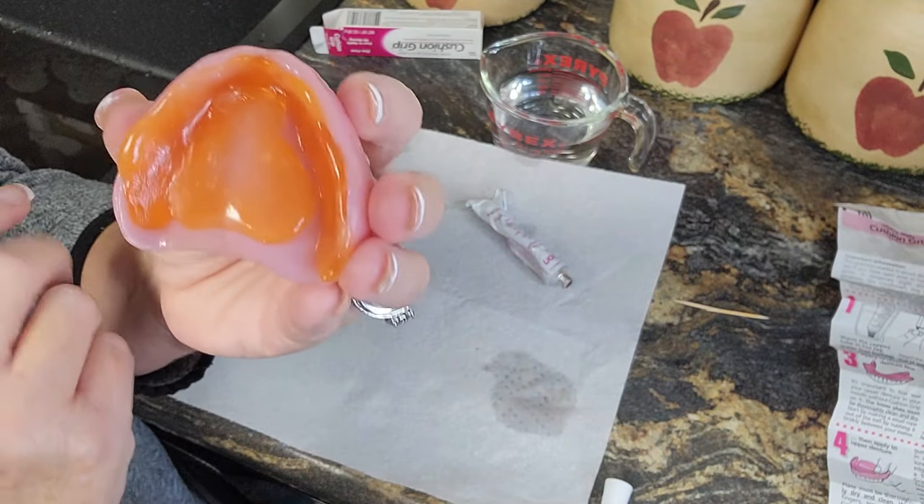Now, you know where on the instructions does it say it has to cure? It doesn't say leave it in for so long or that it has to cure. I did my bottom denture and I just left it — because look at the seal that I created, see that? It's coming out the bottom, which means I got a good fit and a good seal. Let's put this top denture in — it's all up around here.